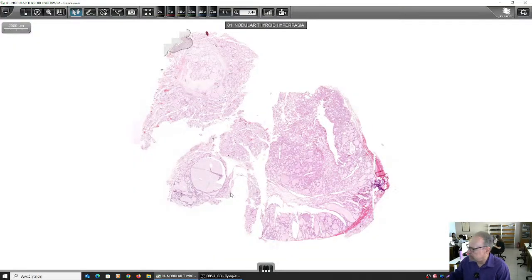Everybody who gets this slide in the exam, then he'll go and have a joker. He'll play the pools. What is this?